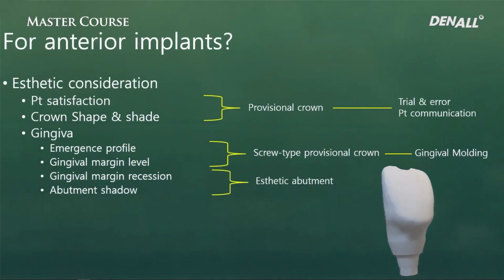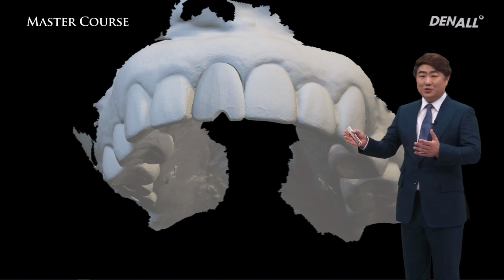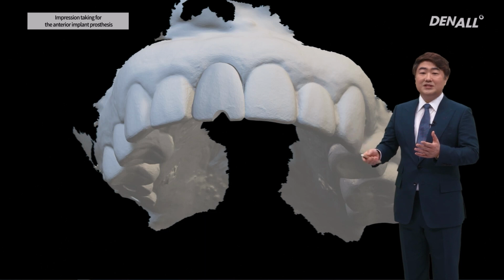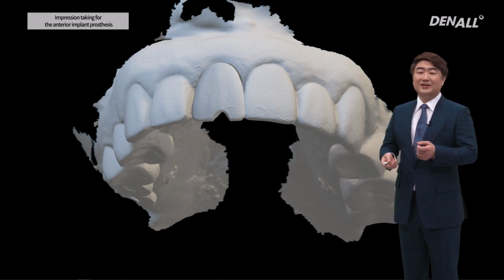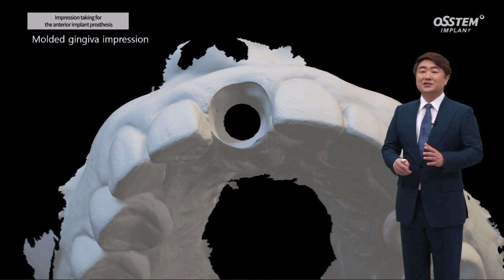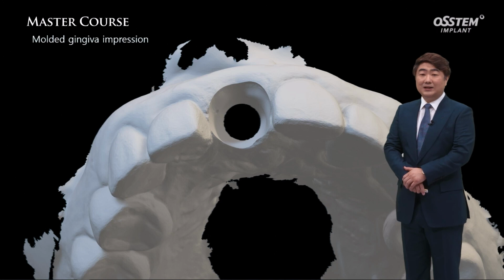In other words, in achieving these goals, you deliver this screw type temporary and go through various steps of revisions like this. The patient is satisfied and the gingiva molding is done. If you think it's sufficiently done, then you take an impression or you have to scan it. And at that time, rather than conventional impression taking, you need more information.